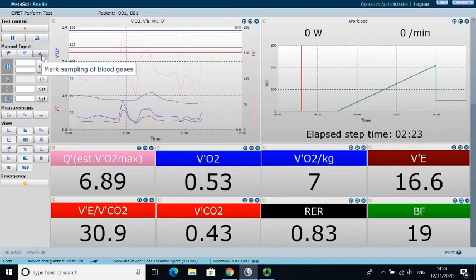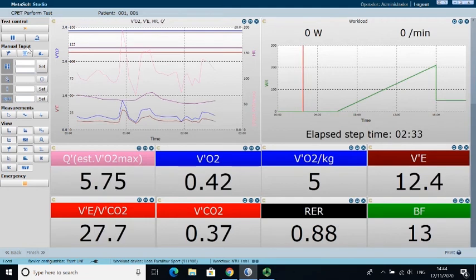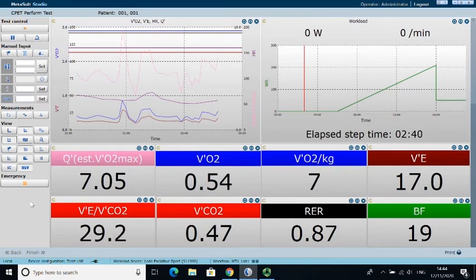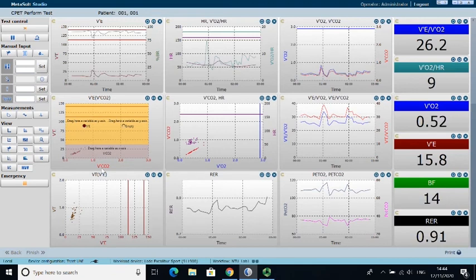What I'm showing you here as well is something that's fairly simple, but quite nice to have. If you're interested in taking RPE measurements or SpO2, so peripheral oxygen saturation, which we are, you can record them on a different device and then input them here and set them. That will store those values on the computer at that point in time, which allows you to keep everything in one place rather than having sheets of paper that you're writing values on and then trying to bring them together afterwards. You can keep it all in one place, and so it makes it a little bit easier to look after and use effectively.